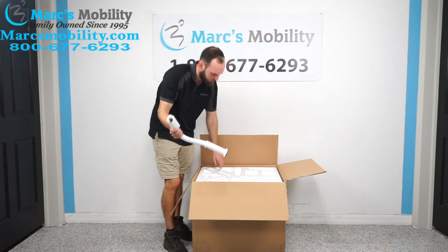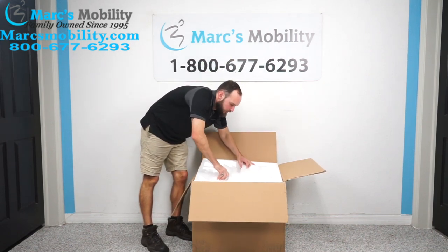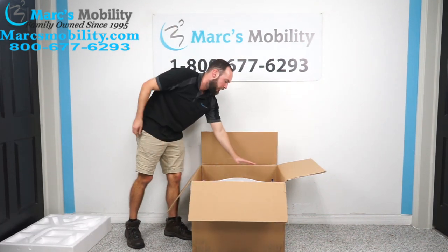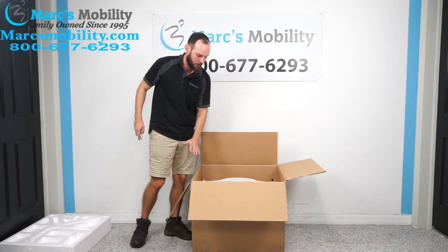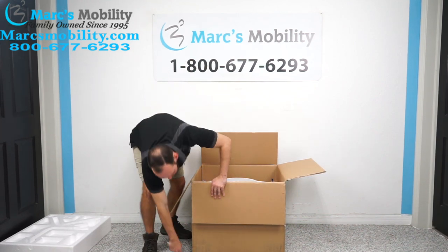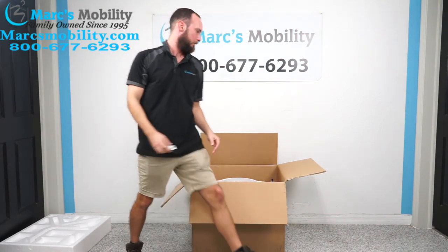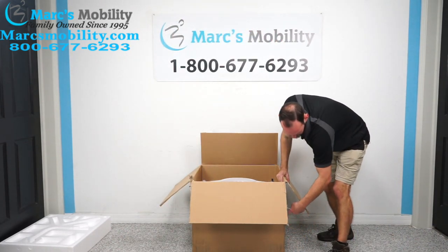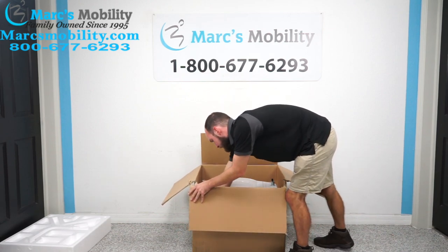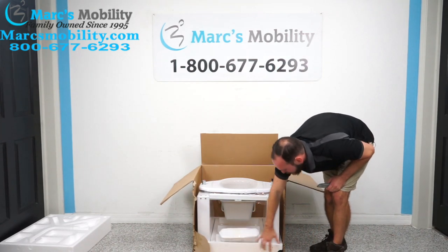Then we have our handles here — we have both on top. Next I'm going to lift up this piece of foam. From here we actually have our toilet lift fully assembled, or mostly assembled, in the bottom of the box. Here's your lift sitting on this piece of foam in the bottom.